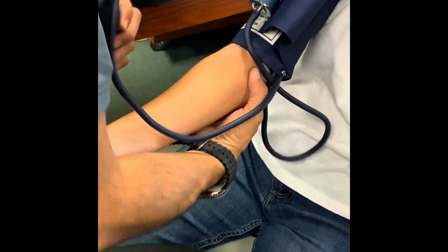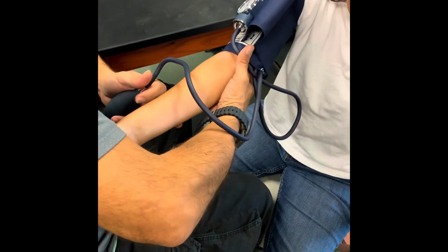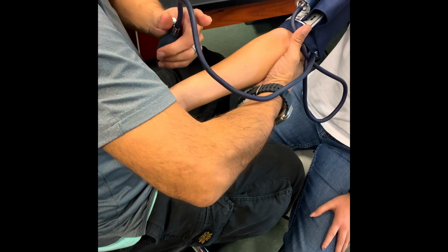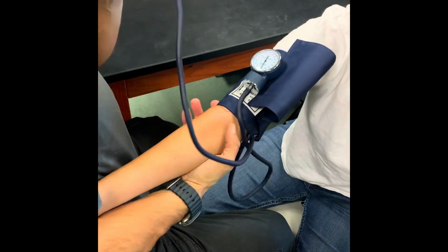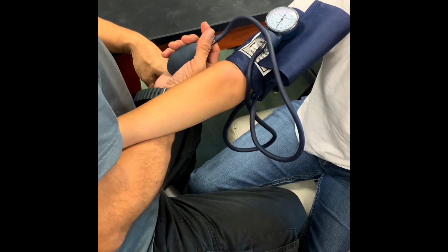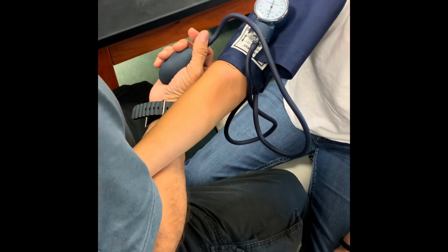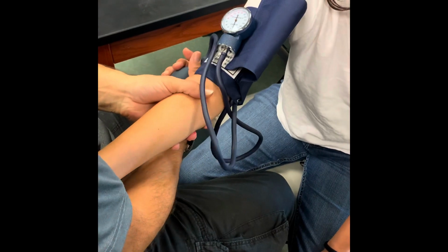To start, we're also going to have her sit up a little bit, and you're gonna use her arm and put her arm, or his arm, whoever you're working with, in between your elbow and the side of your body. So this is what you'll do. Move your hand, and you'll use the same hand with the arm you're holding to do the dial. Because when you use the scope, you have to use your left hand. I use my left hand to hold the scope on. So it looks something like this.